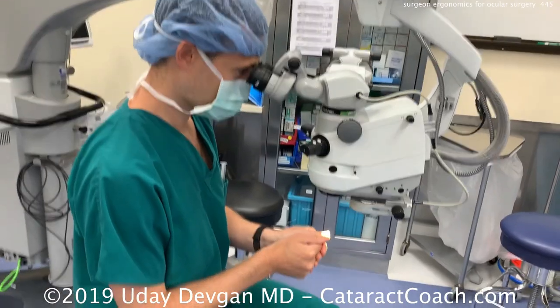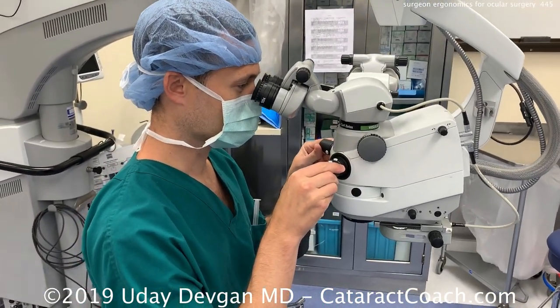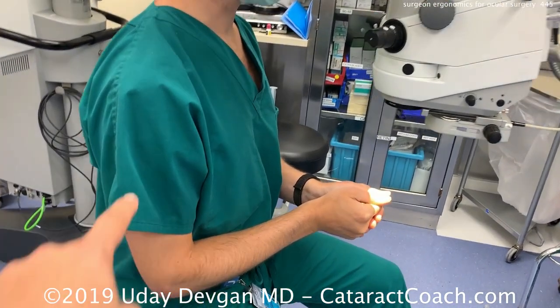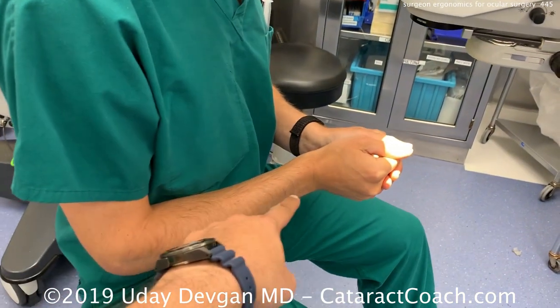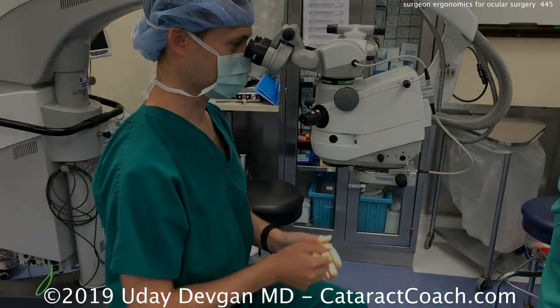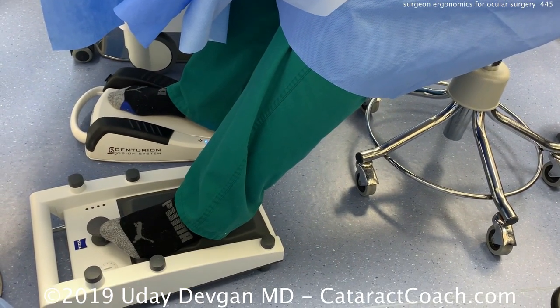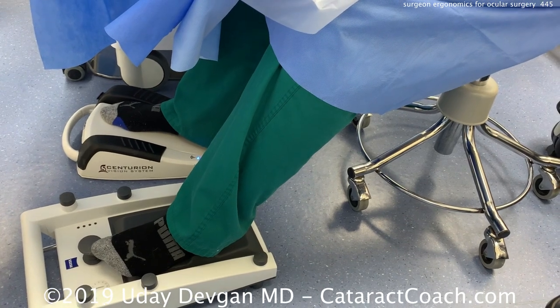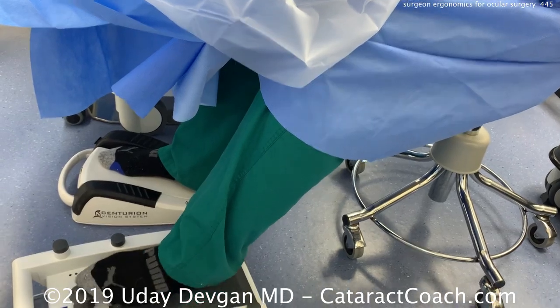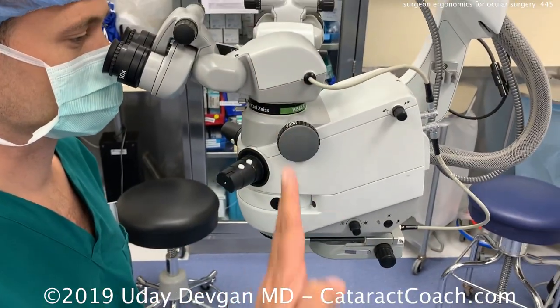Get the patient's eye a little closer to you so the scope can be closer, and then you can have your back straight up and down with just a slight tilt. Your back should be perpendicular to the ground with a 90-degree bend at the elbow joint — that's a nice comfortable position. I tend to operate as this resident is doing: just using socks. I kick the shoes off and operate in socks.